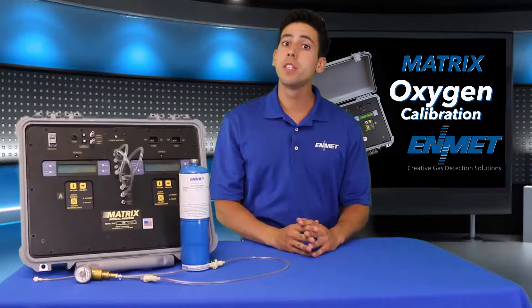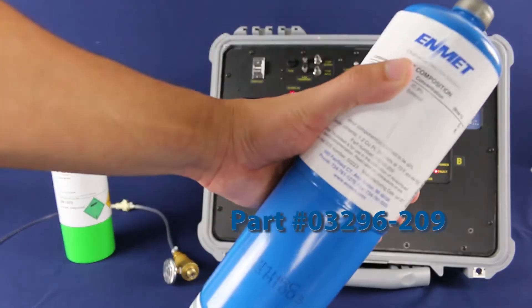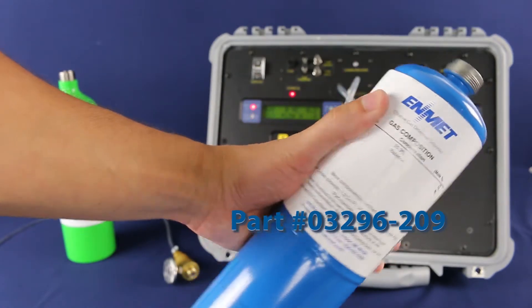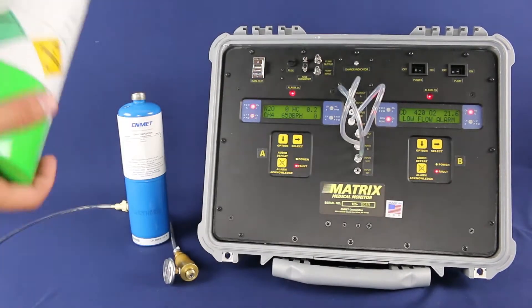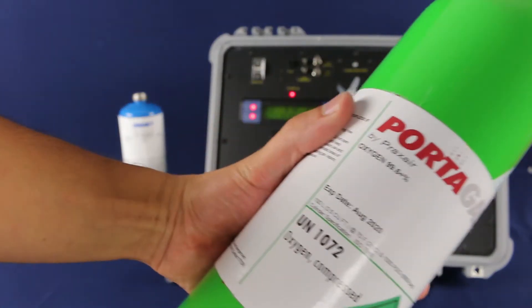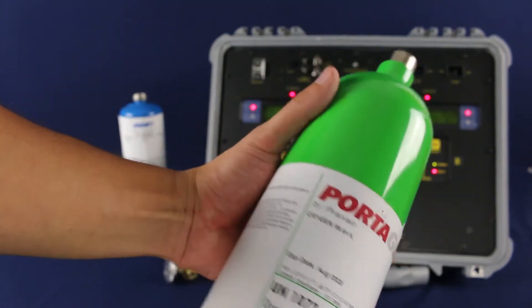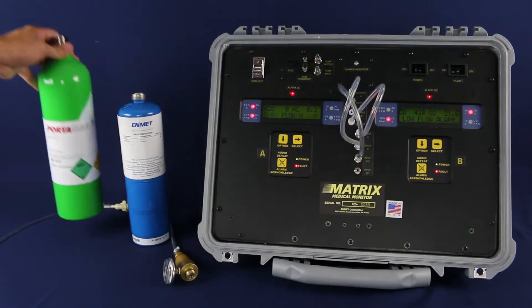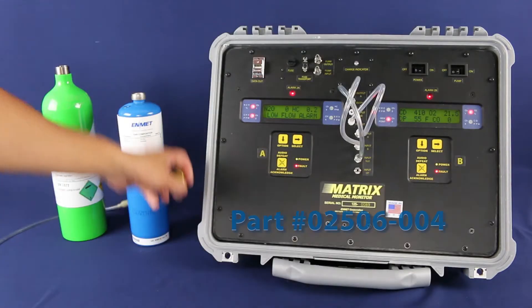Before you start, you will need the following calibration equipment on hand. A compressed gas cylinder of 20.9% by volume oxygen or clean compressed air for the low range calibration. If you are doing a high range calibration, you will need 99.6% by volume oxygen. Edmet is not able to supply this, so you will need to have your own source of 99.6% by volume oxygen to calibrate 0 to 100%. And finally, you will need a calibration regulator.